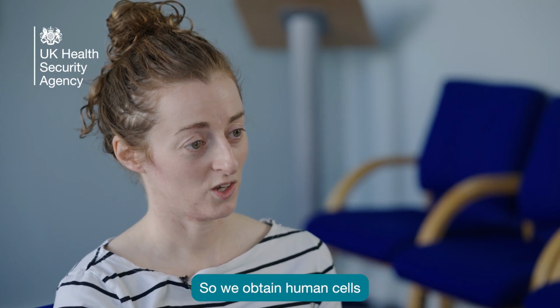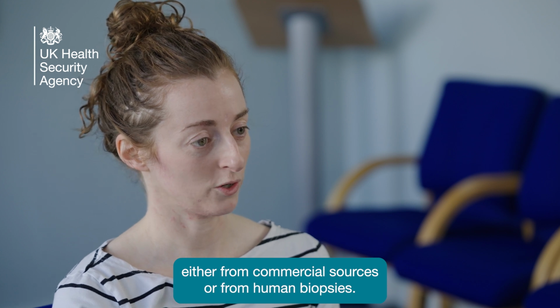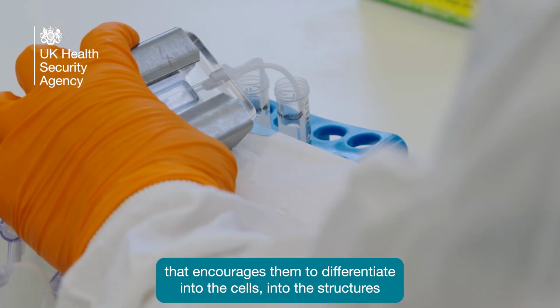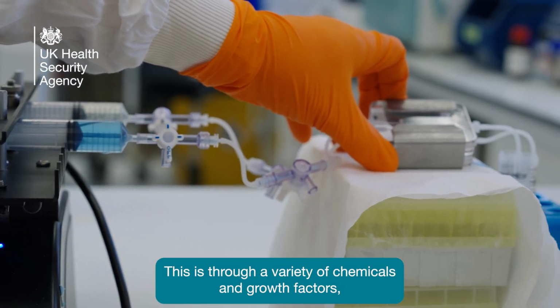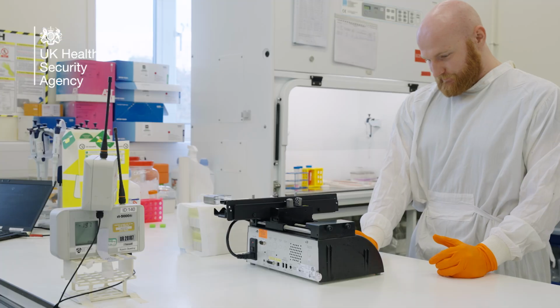So we obtain human cells either from commercial sources or from human biopsies. And when they come into the lab, we culture them in a way that encourages them to differentiate into the cells, into the structures that we see in the human body. This is through a variety of chemicals and growth factors and growing them at a temperature at which you would expect in the human body.